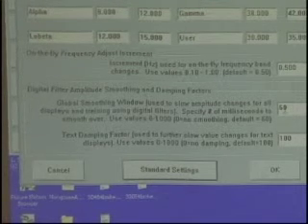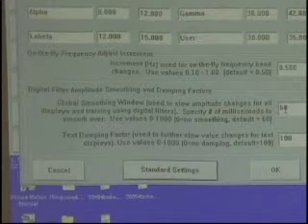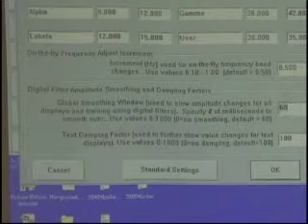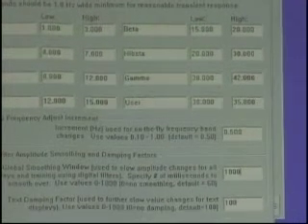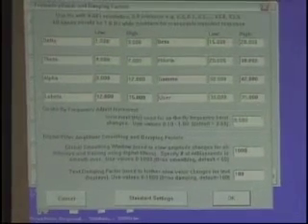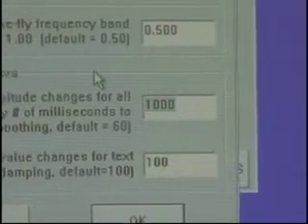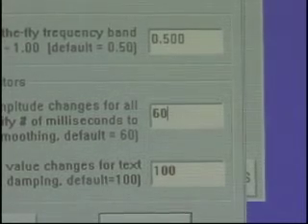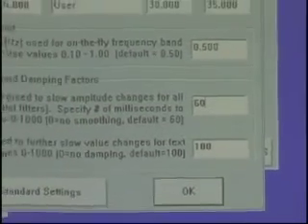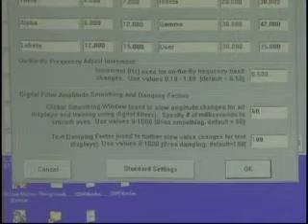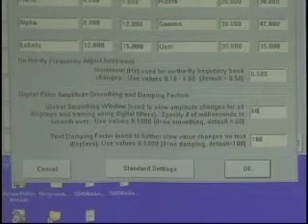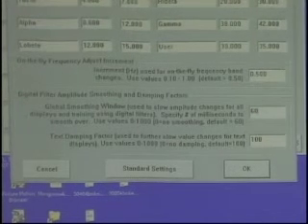We've always defaulted it at 60 milliseconds — pretty fast. But if you take it up to one second, a thousand milliseconds, the thermometer is going to be nice and smooth, but are you in real time anymore? No. You have to keep that in mind. It may make sense sometimes, but it's not always the right call — you're giving up instantaneous information to the brain.